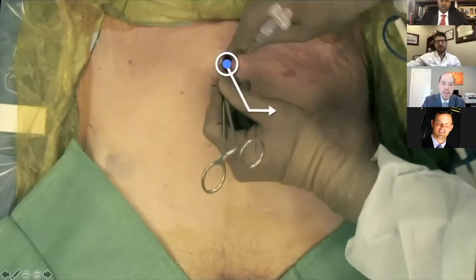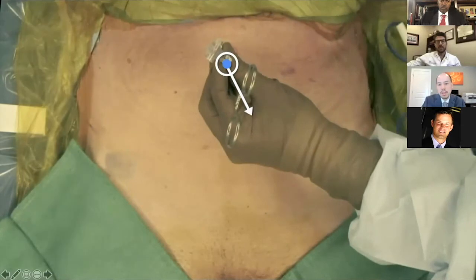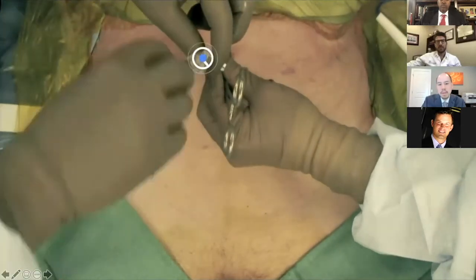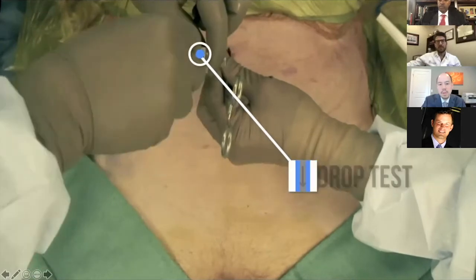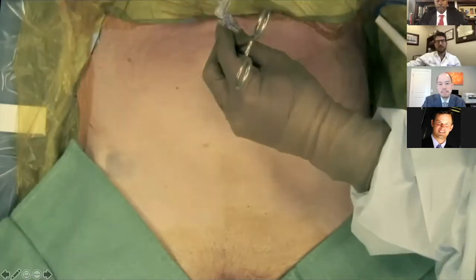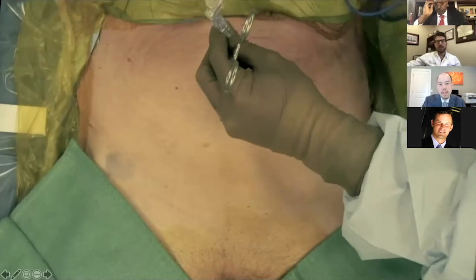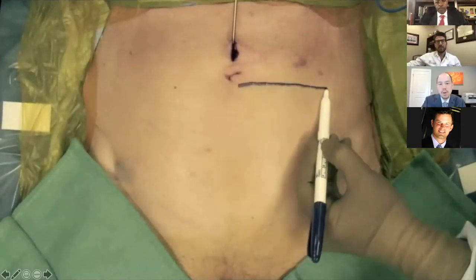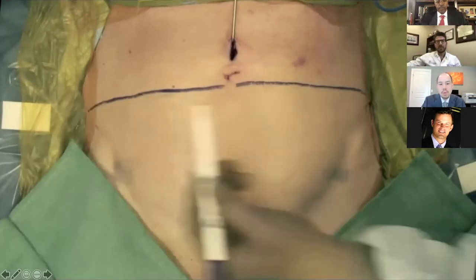We'll dissect down to the fascia, grasp with a Kocher, and place a Veress needle. We'll use a drop test to confirm placement and then begin insufflation. Instead of incising the fascia, we use the Veress here so that will prevent any leakage. While we're insufflating, we'll go ahead and mark out our port placement.